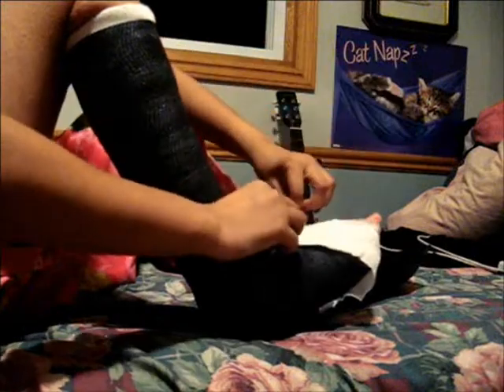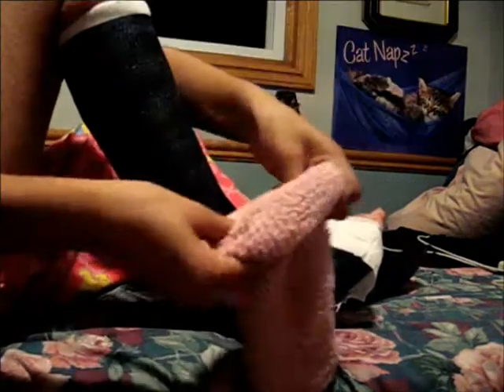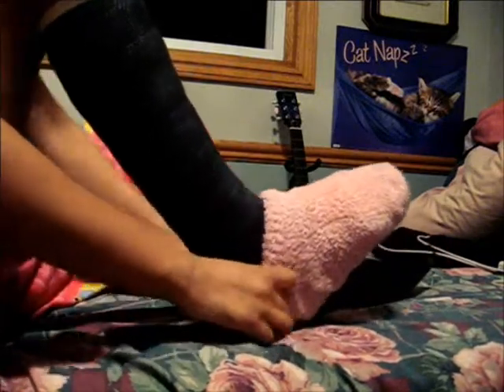It's pretty self explanatory. We'll just start off by putting on your bandage. The bandage is just going to prevent any infection, and you're also going to want to put on a sock in case any bugs go inside.